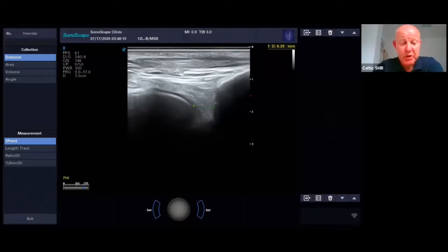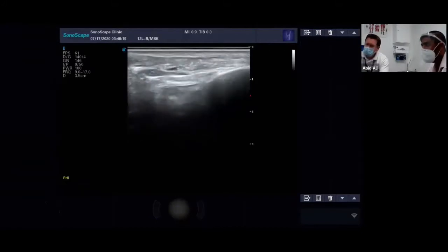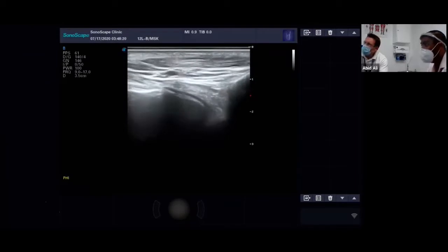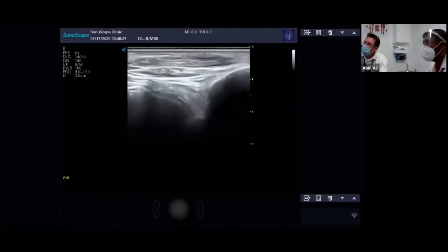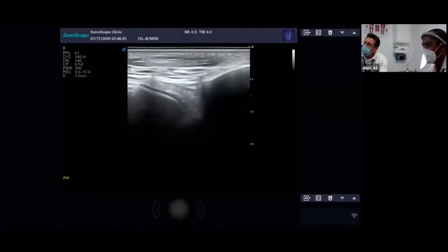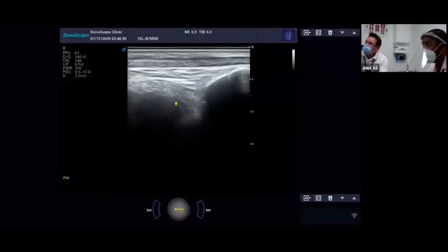Do you measure in neutral position, Abid? Yeah, preferably, but it just depends on the anatomical variance. Bear in mind, everyone's bits and bobs going different directions. I was interested in watching ankle ligament cadaveric studies. We always try to look for ligaments in the same plane with most people, but they are very, very different. A lot of individual variations.